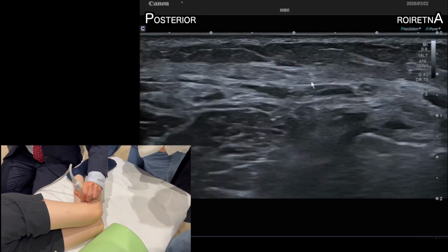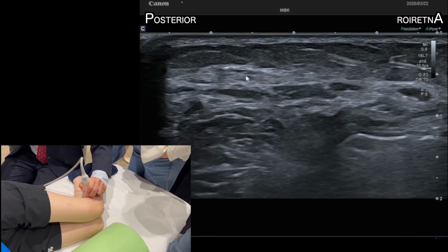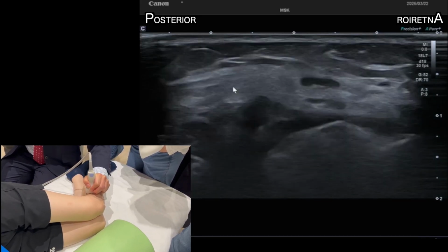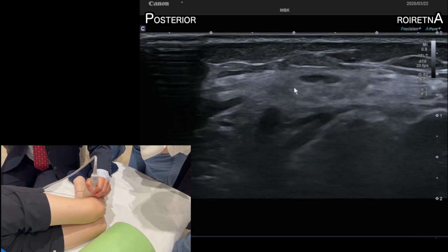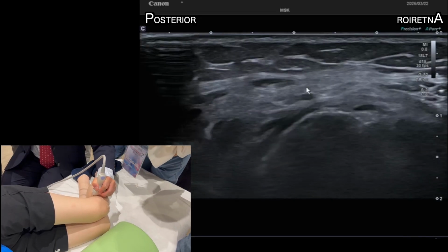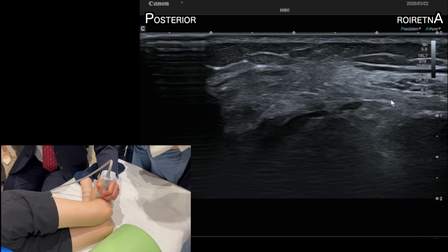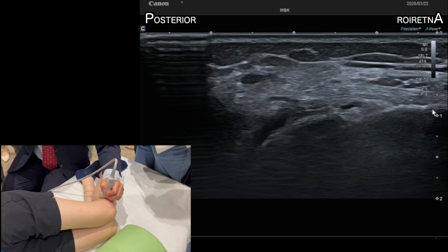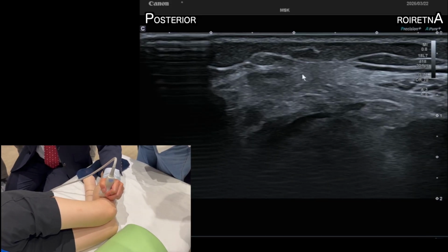And then one more thing: now I'm directing attention to the LCL and biceps femoris tendon, scanning distally. LCL is coming here, but we will ignore this for now. Pay attention to this. It will send a fiber here, here, here, here. This is the tibia, by the way. Do you see that tendinous structure inserting to the tibia? That's the tibial arm of the biceps femoris tendon.